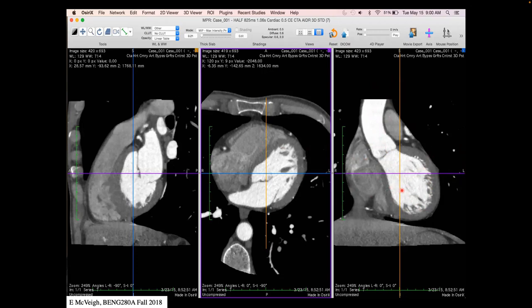The blood pool appears very bright because the injected contrast agent contains iodine, which is highly efficient at stopping x-rays. This creates fantastic contrast between blood pool and myocardium. Air provides great contrast too, while myocardium and liver are hard to distinguish without contrast. The sagittal view is obtained by cutting down the middle from head to feet, looking from the left side toward the right.